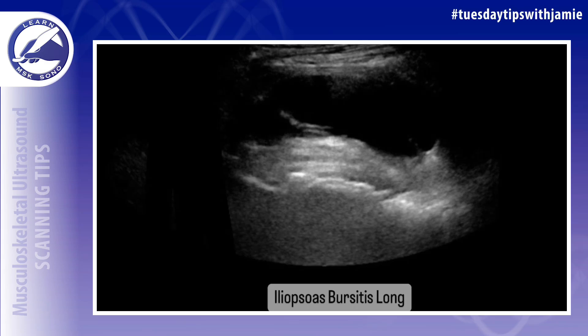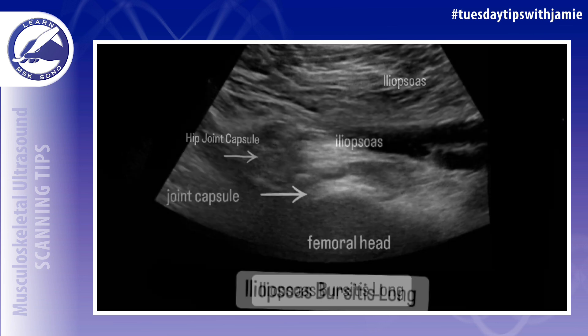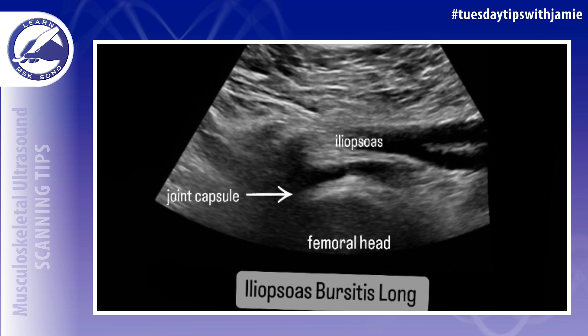Do you know where to locate the iliopsoas bursa of the hip on ultrasound? The iliopsoas bursa lies between the iliopsoas tendon and the anterior capsule of the hip joint. When inflamed, it can be the source of anterior hip pain.